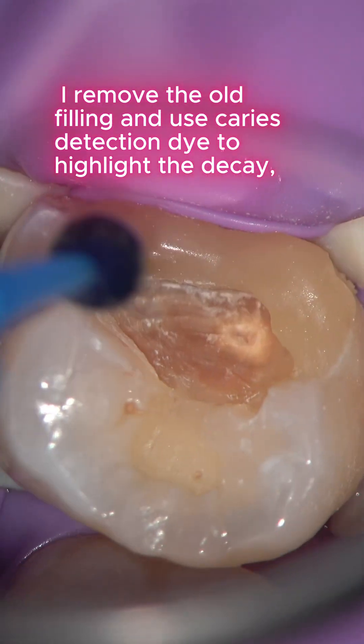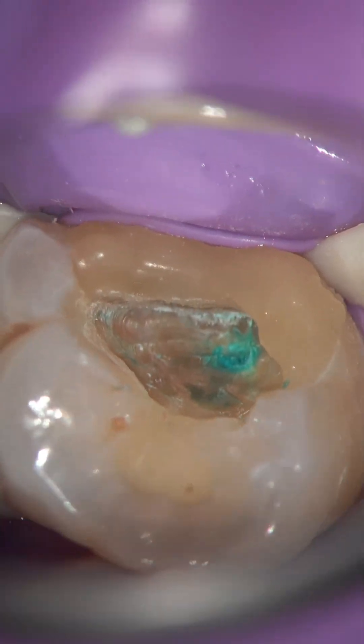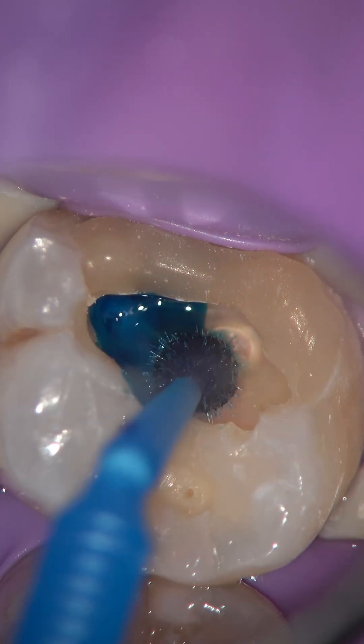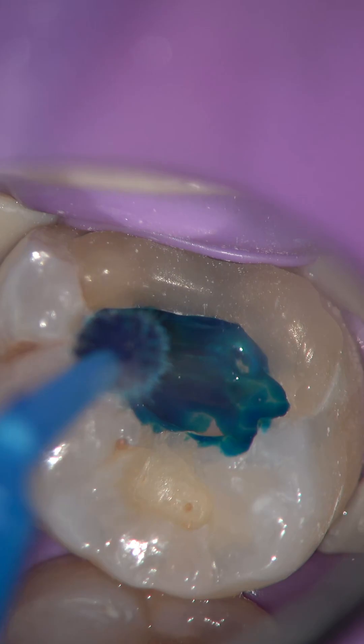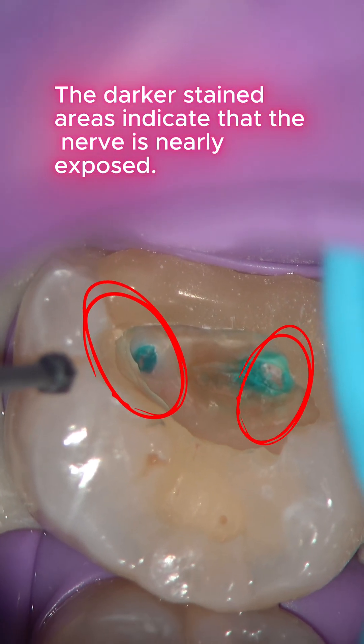I carefully remove the stained areas. Then I apply the dye again — the darker stained areas indicate that the nerve is nearly exposed.